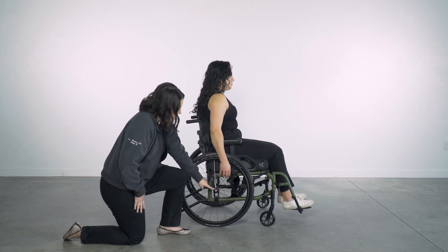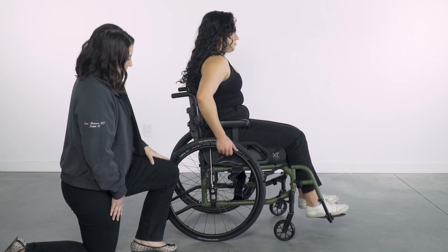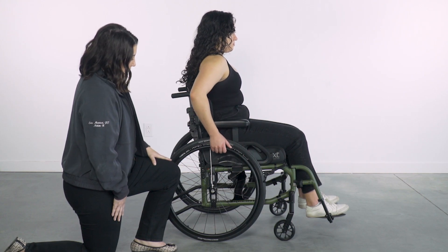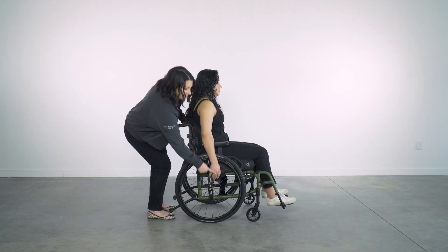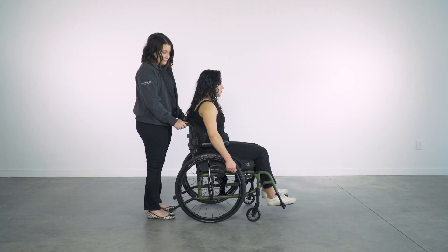Here the axle is behind the shoulder. This can restrict access to the rear wheel for propulsion and places more of the client's weight over the casters — this chair will feel heavier. The axle is now in line with the client's shoulder. She can now access more of the hand rim for an efficient push stroke. This is a more mechanically efficient position.